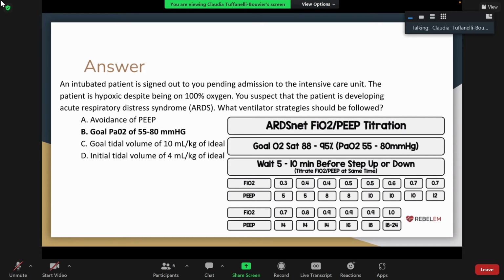In order to do that, there's something called ARDS-net, which is a really good set of guidelines. If you have a patient you're suspicious for ARDS, acute respiratory distress syndrome, or even they have a serious lung condition, severe lung disease, severe COPD, emphysema, you can follow ARDS-net on your titration of ventilation and even when you're initiating your ventilator setup. So you want them to have that.